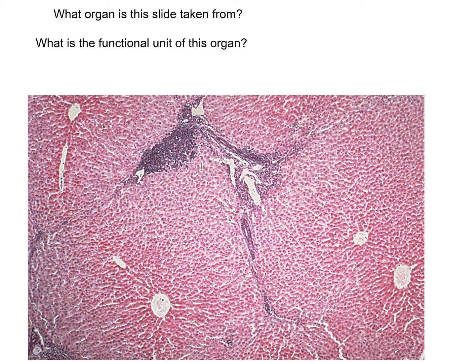The lobules of the kidney? It is not kidney. The pancreas. No. Is this the liver? It's the liver. Yeah. Oh, lobules. And lobules are the functional unit, yes.